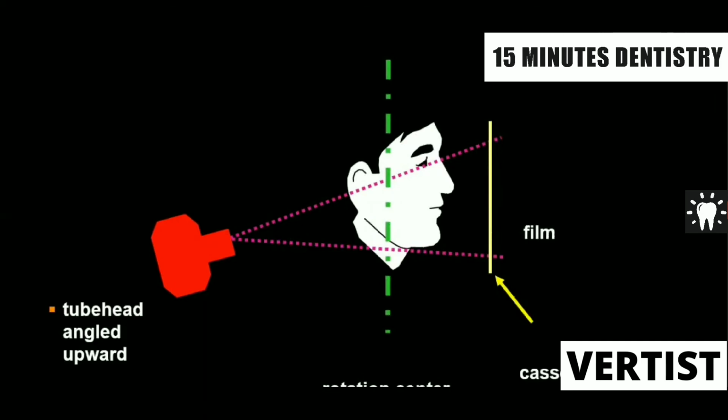Ortho we call as correct or proper. As you know, there is orthopedics, there is orthodontia, where there is a proper alignment. So whenever there is a correct or the proper one, the right one, we call it ortho. And then there is another one called panorama, that means a bird's eye view. That means when you go to the top of the hill and look down towards the valley, you can see a complete part of the valley. The same we can see in the OPG from the right condyle to the left condyle, so we call it the panorama. And a very important one is the tomography.